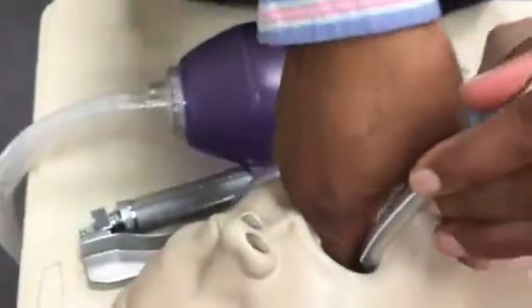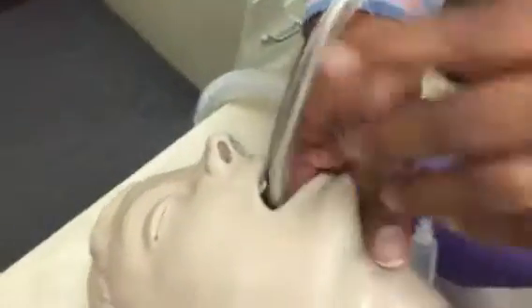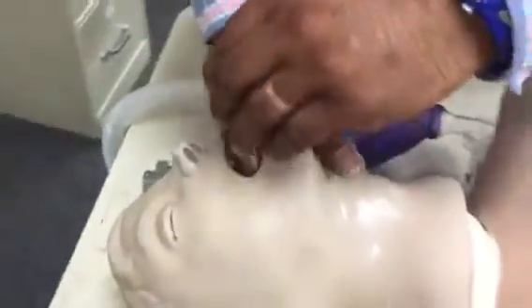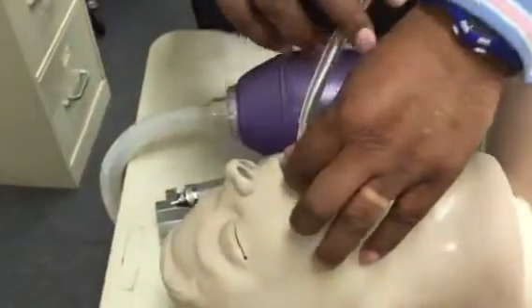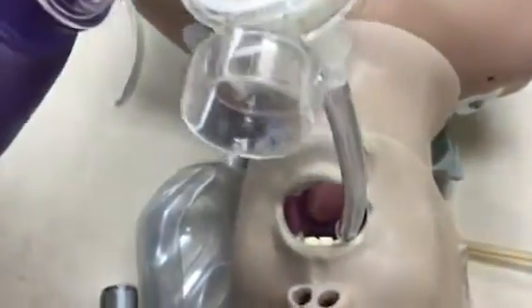The landmark is the epiglottis. I'm going to slip the tube in between my fingers and the tongue. I'm going to hyperextend the head. I'm going to pin the tube in between the epiglottis and my fingers and I'm going to insert it through the hole, which is the glottic opening between the vocal cords. I'm going to ventilate.